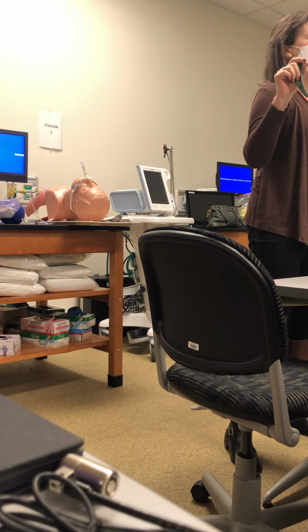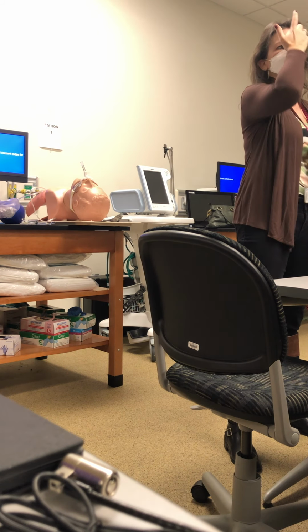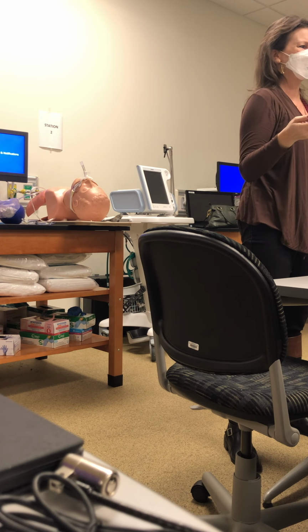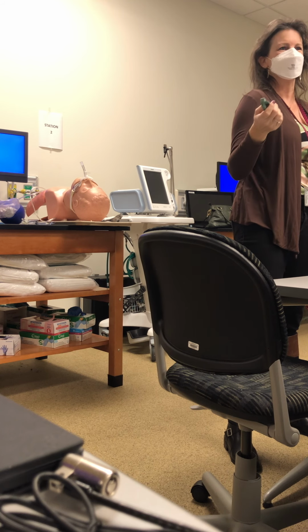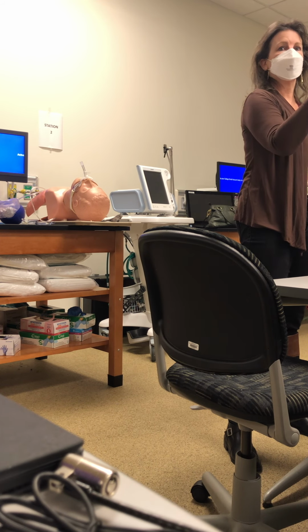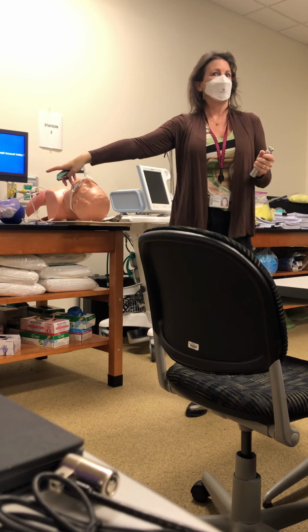The sizes we use for adults are 3 and 4. In your PowerPoint, it just says 3. But we use 3 and 4 in the critical care or on anybody that we're intubating for adults. And you can get a 3 or 4 size for a Macintosh, 3 or 4 size for a Miller, okay?